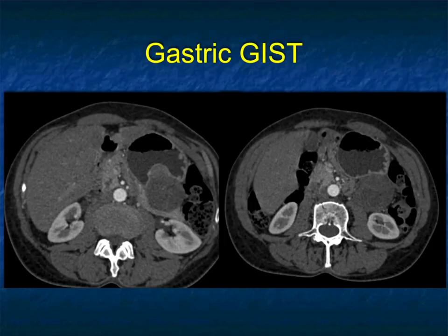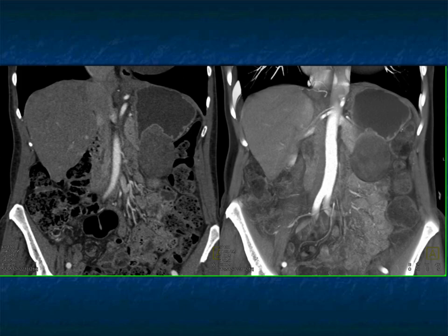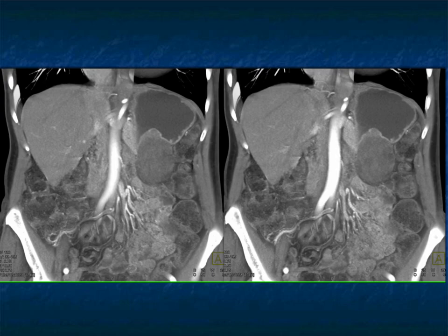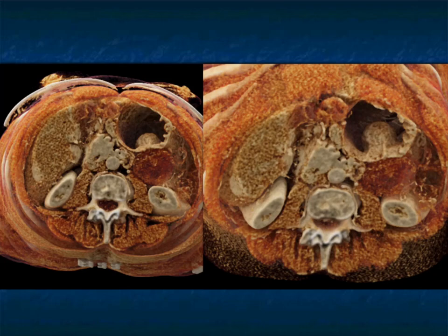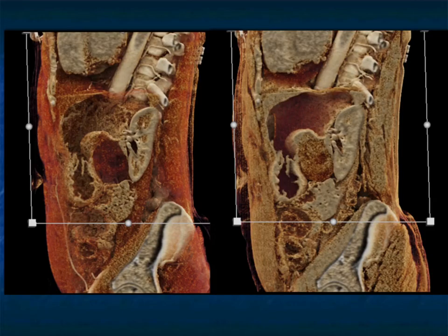Another example just to show you — GIST can sometimes be cystic. Here it's pushing into the lumen but is mainly exophytic. Don't confuse it with a pancreatic mass, adrenal mass, or retroperitoneal mass. Sometimes it's tricky — is it a big mass pushing against the stomach or coming from the stomach? In this case the dumbbell appearance makes it very easy. Cystic GIST tumors are not uncommon. Solid GIST tumors can become more cystic if patients are treated with Gleevec. You can see here it's pushing on the left kidney, pushing into the stomach, but mainly considered exophytic.